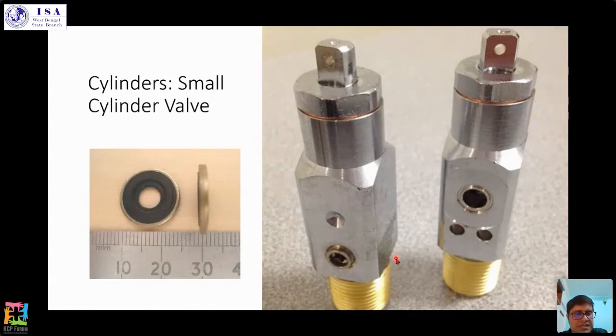Now, this is called a Bodok seal. This goes in here and creates a seal between this and the yoke assembly. It is structured so that it's made of a softer material and has a metallic rim around it. It's made of a specific material called neoprene rubber. Other things like nylon or natural rubber will not work and will not be able to produce such an effective seal. Neoprene rubber is a type of modified natural rubber. So this produces an excellent seal, and this Bodok seal has to be used when we are putting a cylinder on the yoke assembly.